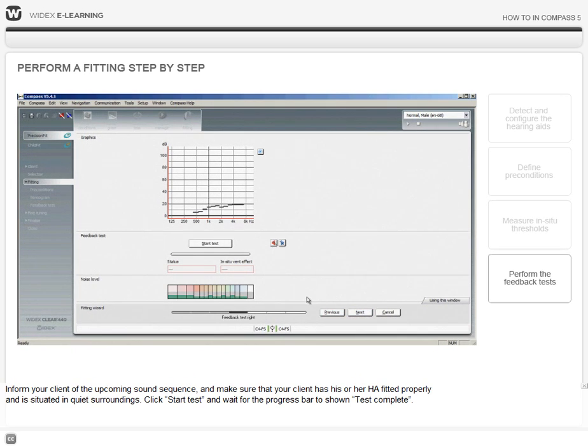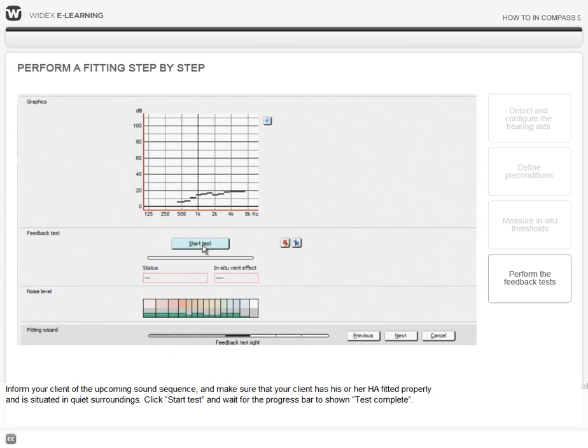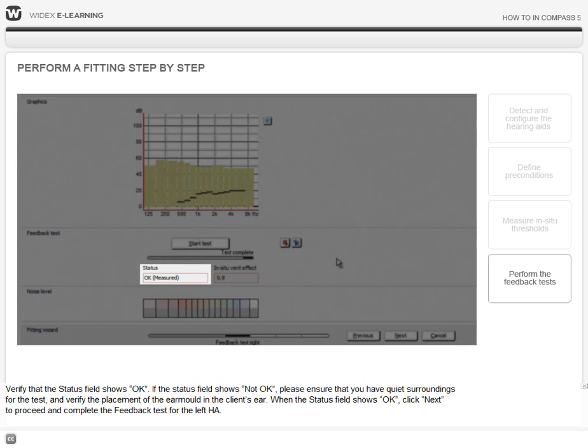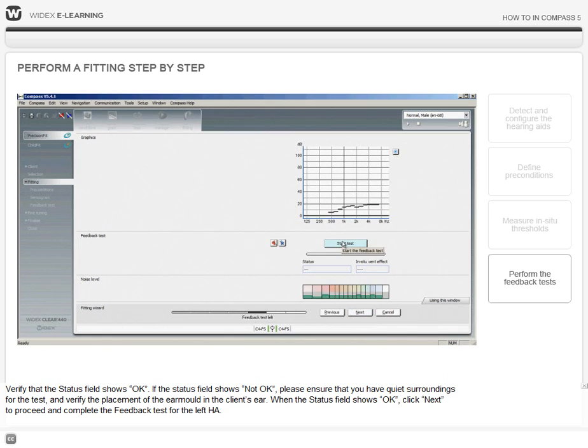Inform your client of the upcoming sound sequence and make sure that your client has his or her hearing aid placed properly in the ear and is situated in quiet surroundings. Click Start Test and wait for the progress bar to show Test Complete. Verify that the status field shows OK. If the status field shows not OK, please ensure that you have quiet surroundings for the test and verify the placement of the ear mold in the client's ear. When the status field shows OK, click Next to proceed and complete the feedback test for the left hearing aid.